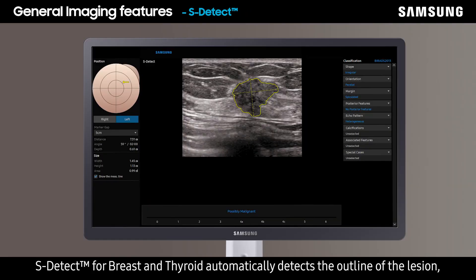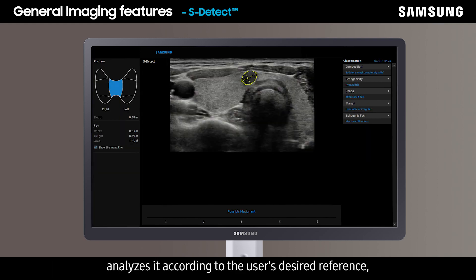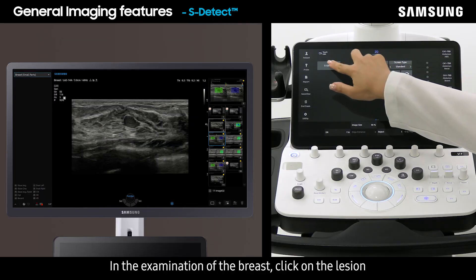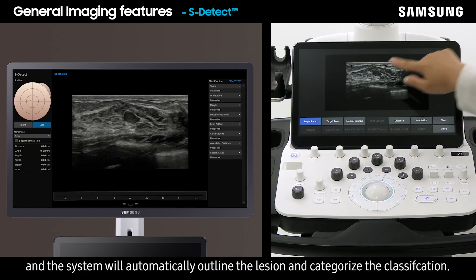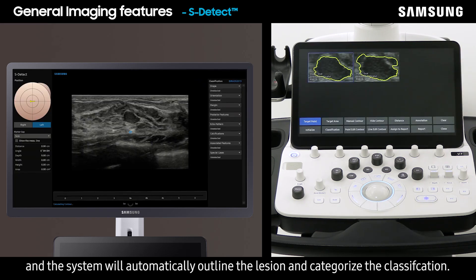S-Detect for breast and thyroid automatically detects the outline of the lesion, analyzes it according to the user's desired reference, and displays the character of the lesion. In the examination of breasts, click on the lesion and the system will automatically outline it and categorize the classification.